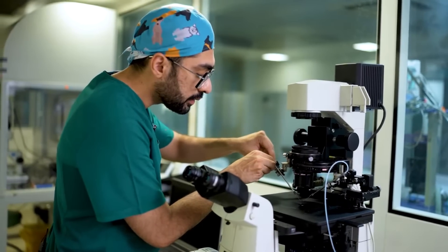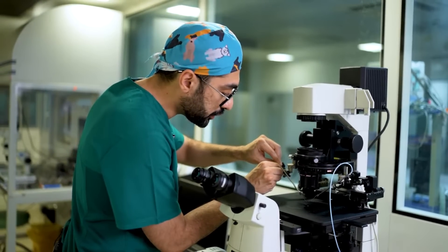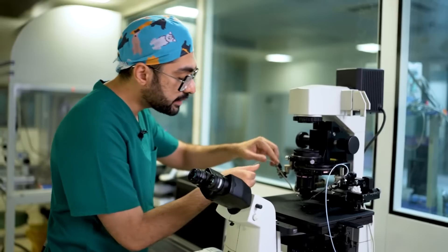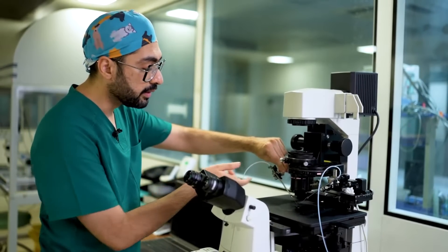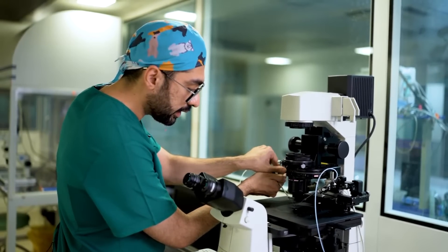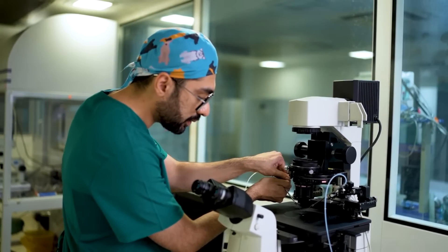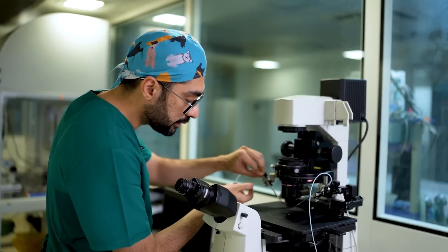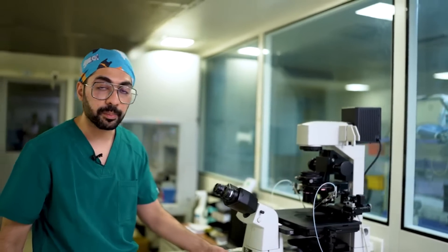There are times where the pipette might not be centered or you might have certain issues with positioning it. In these situations, you can just loosen the main knob right here and then use your hand to align it in a more proper fashion. As you can see, I can just twist it around till it's in the center, and that's basically what will finish the alignment process.